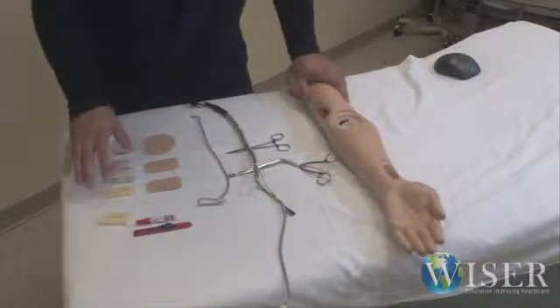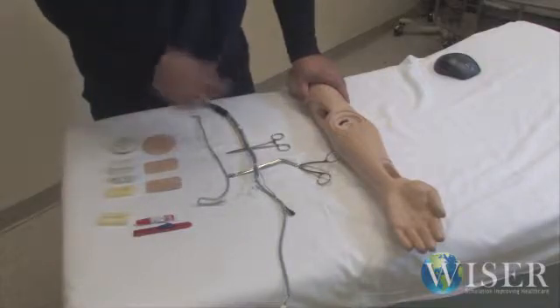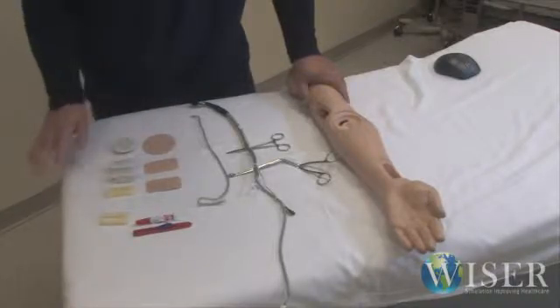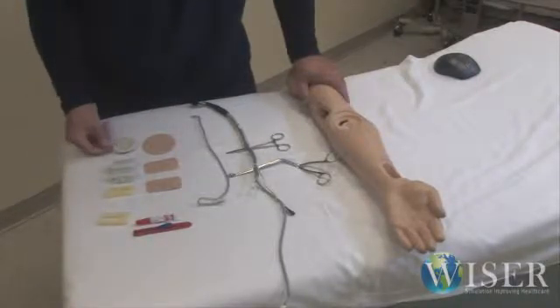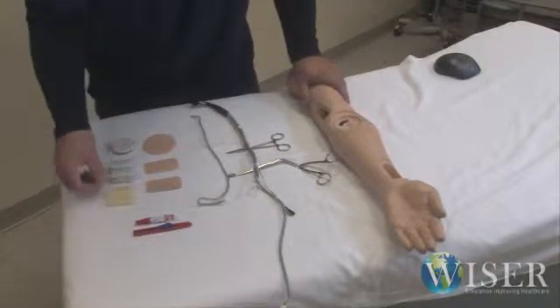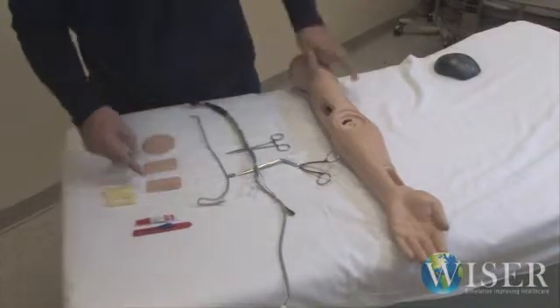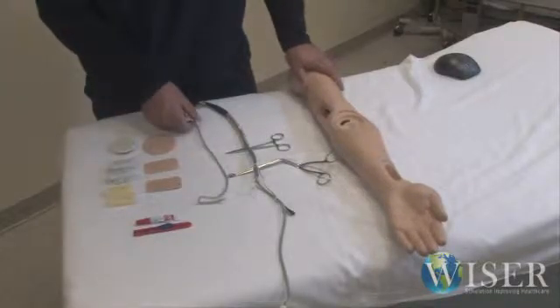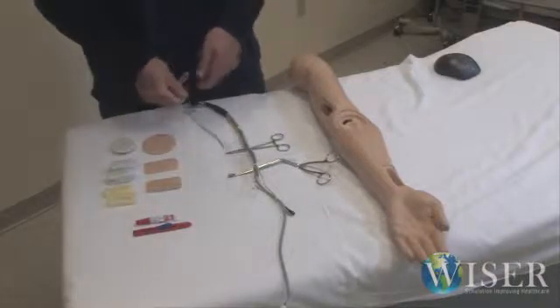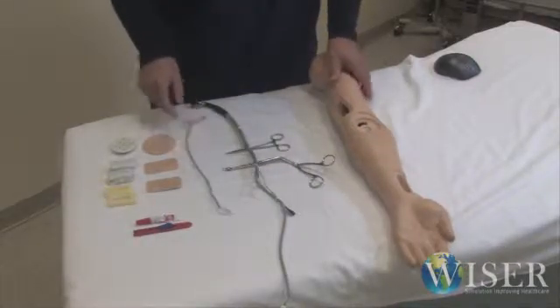And this is also the tools that will make replacing a module or removing the piece of the skin here to get to the module the easiest from start to finish. So we have our speaker here for our blood pressure. We have our modules for the pulses. These little foam guys go over top of the modules like that. Once they sit in there, these are our skin flaps. This is an ET tube stylet, which is just a really helpful tool to get the wire down through the arm. And I'll show you a little bit of that later.